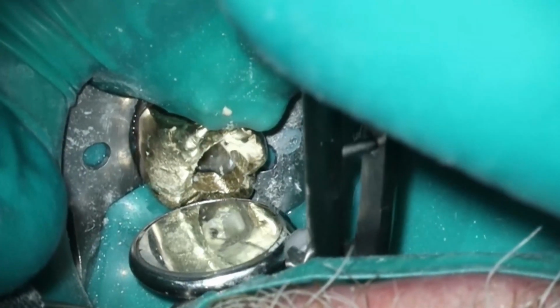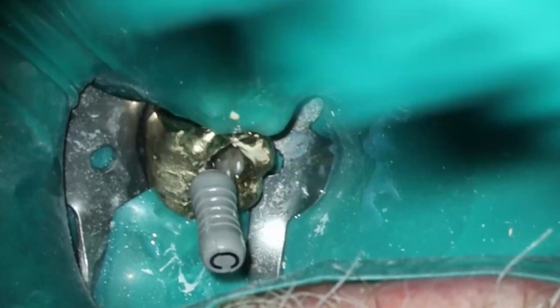And then I'm just double checking here with an 8 to make sure we are truly patent all the way. And that felt great. For those of you who have been doing endo long enough, you know the feeling when you actually drop into patency. It's a very different feeling than when you're working everything up. It's like the pressure is almost relieved once you've dropped through the apex.